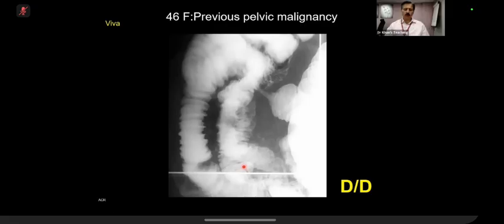When there is an acute process, the capillaries will become leaky, or there can be intramural hemorrhages because capillaries might leak blood. Because of that, you can see these mucosal thickenings, like thumbprints. And then there will be chronic changes where you will see fibrotic stricture.